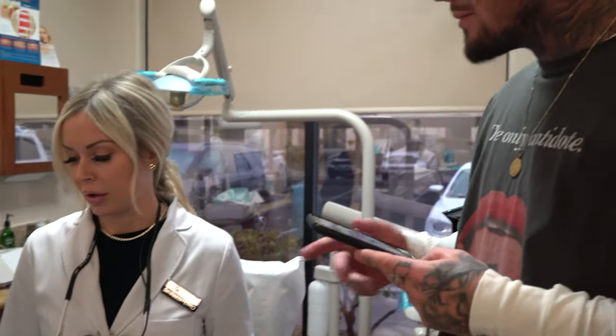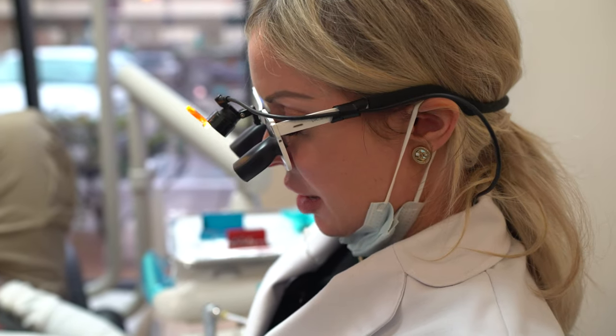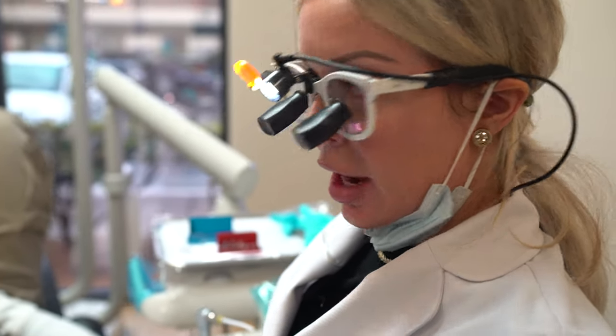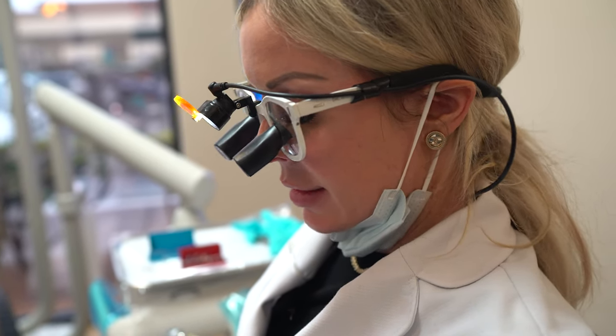So we're about 90% done with prepping out his top 10 teeth for his veneers. I'm going to go back and just double check the preps, refine them, clean them up a little bit. And then after that, we will go ahead and make his temporaries.